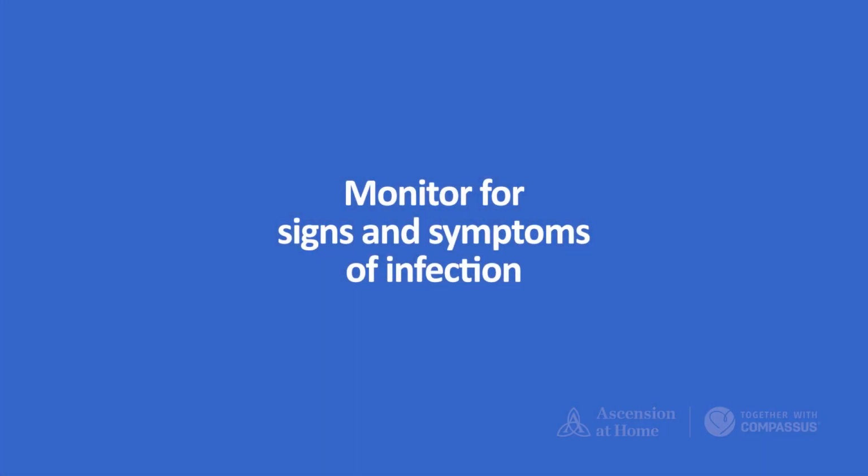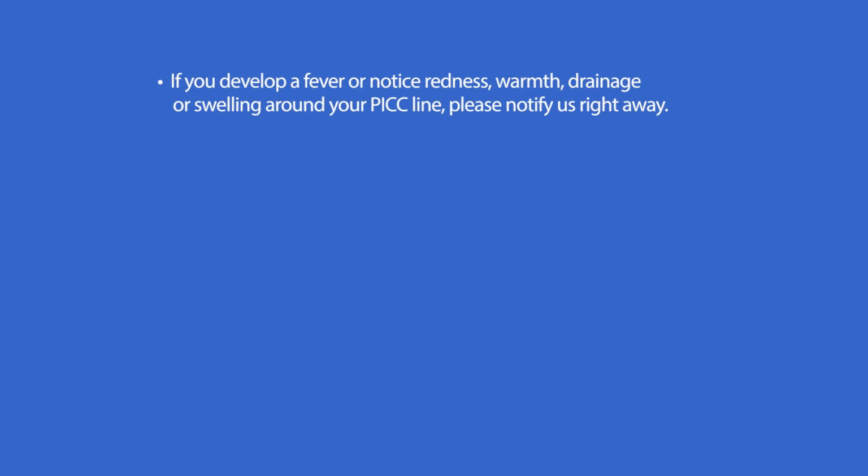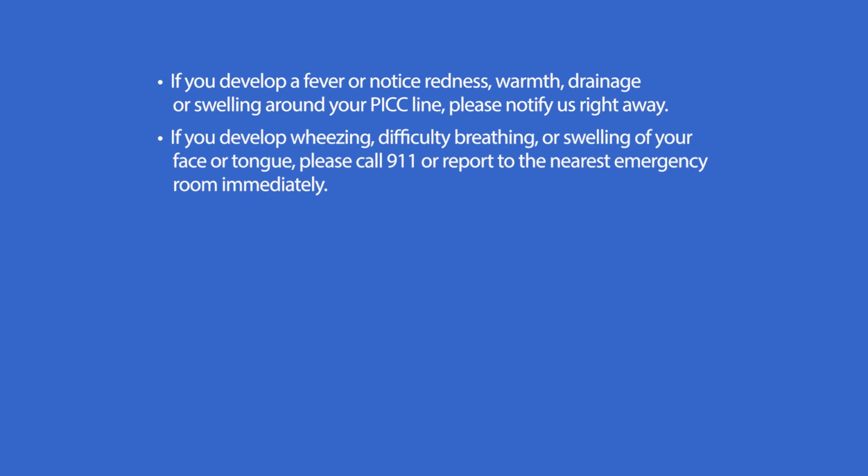Please monitor for signs and symptoms of infection. If you develop a fever, notice redness, warmth, drainage, or swelling around your PICC line, please notify us right away. If you develop wheezing, difficulty breathing, or swelling of your face or tongue, please call 911 or report to the nearest emergency room immediately. If you develop a rash or hives, please contact us right away.